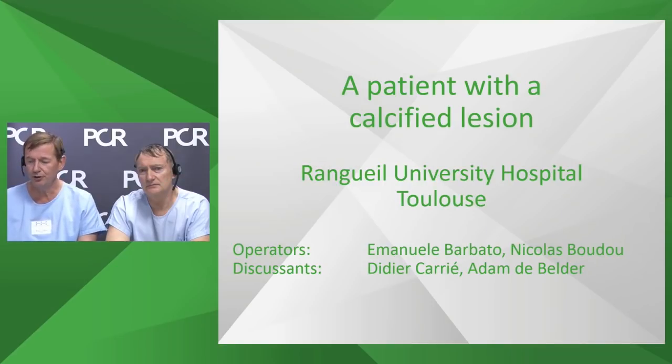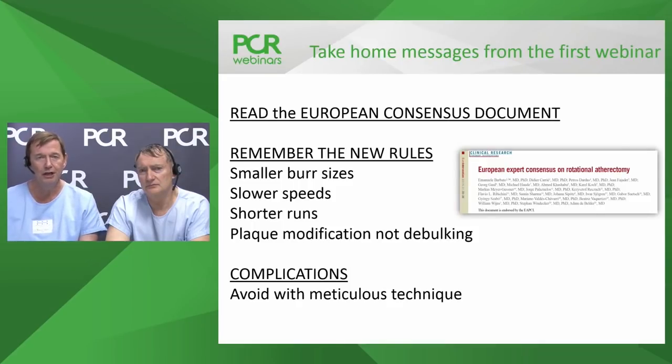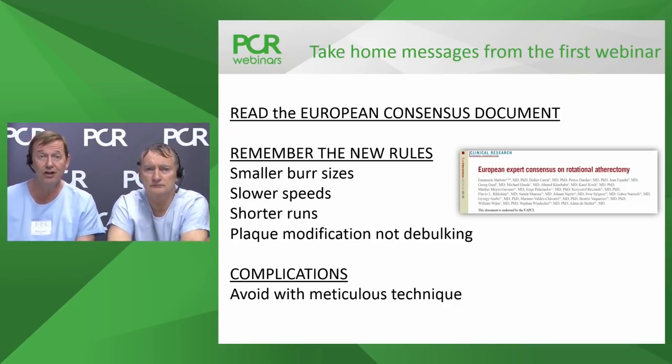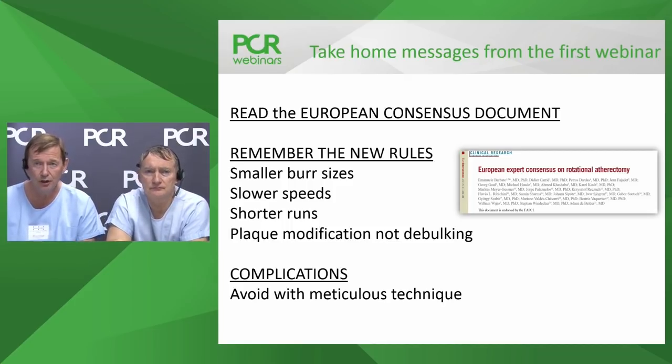So this is a patient with a calcified lesion. From the first webinar, these were the take-home messages: if you're learning this game, the European consensus document is the place to start. It gives you all of the contemporary data on how to become skilled at looking after the calcified lesion, which is almost a day-to-day business in our aging population.